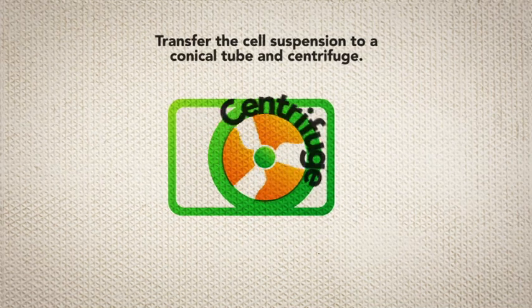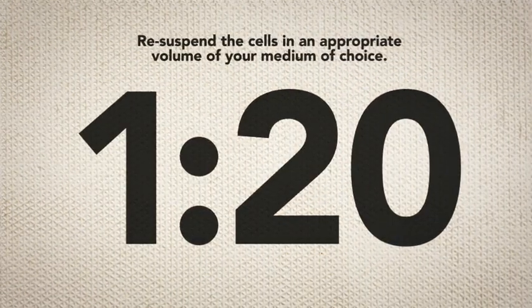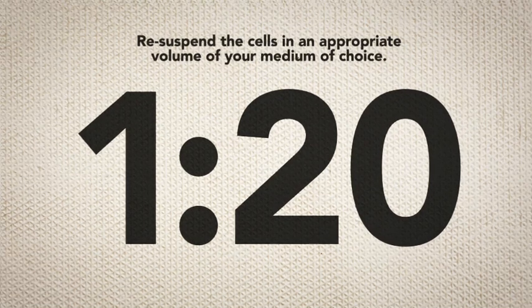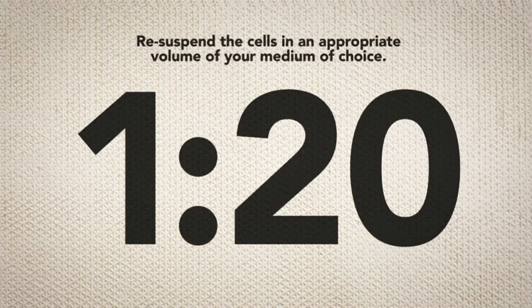Transfer the cell suspension to a conical tube and centrifuge. Re-suspend the cells in an appropriate volume of your medium of choice. You can use a split ratio of up to 1 to 20 when plating on BioLamina's human recombinant laminin 521.